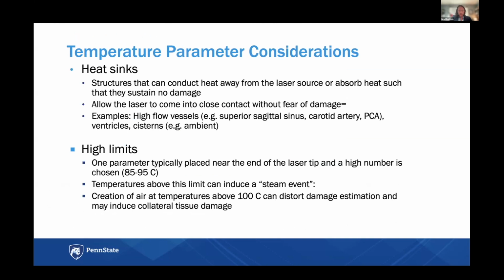So some consideration. Certain structures are heat sinks, so they conduct heat away from the laser fiber or absorb the heat in such a way that they sustain no damage. So you can come into close contact with those without fear of damage. Things like high flow vessels, ventricles, cisternal spaces, which is what affords you to be able to treat near those structures without damage.